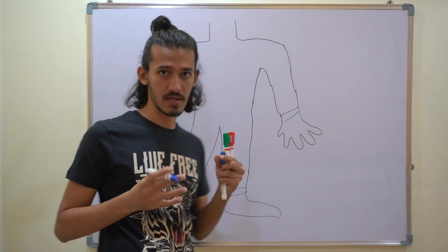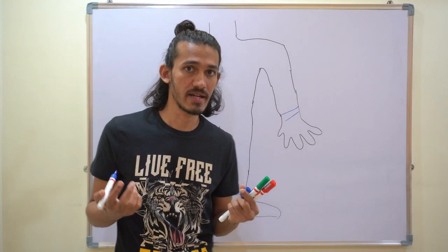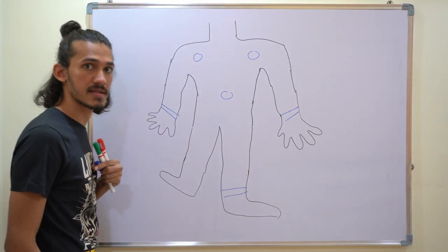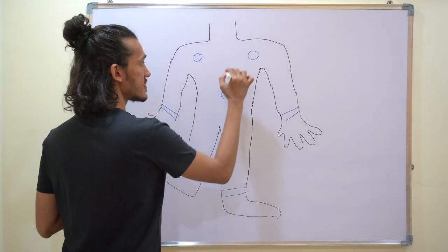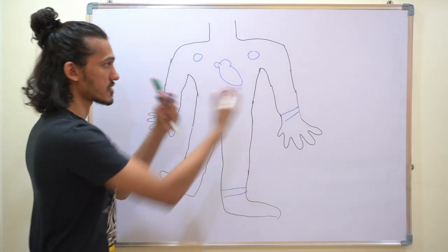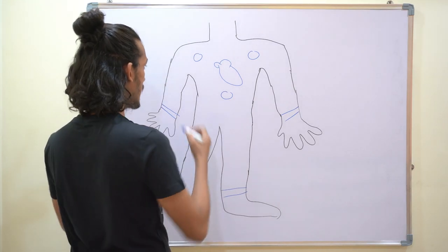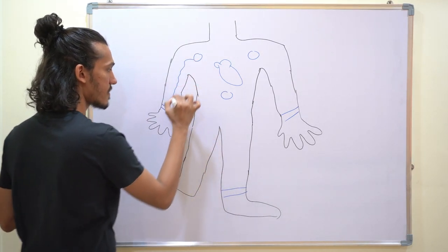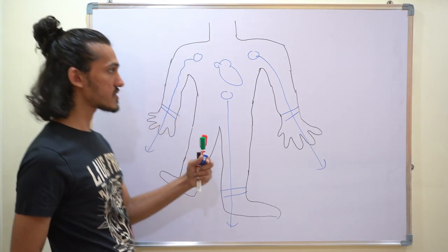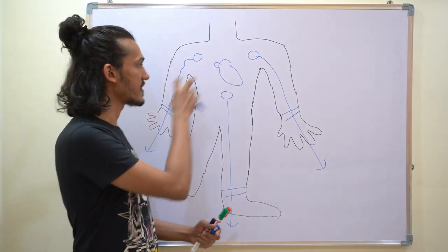Now you know that your body fluid is a volume conductor. It can conduct the electrical activity through it. So in effect, what this is measuring would be this. You get that? So if the heart is present over here, and with respect to this heart, the potentials are recorded like this. This potential will be taken here, this potential will be taken here, this potential will be taken here. So we use your left hand, right hand, and left leg. These are where the electrodes are placed.